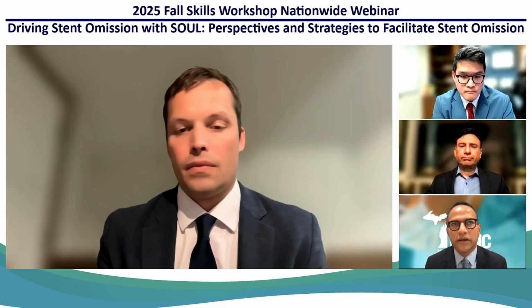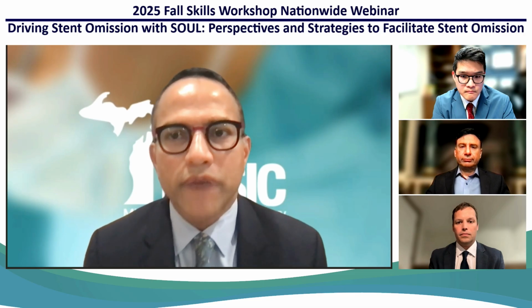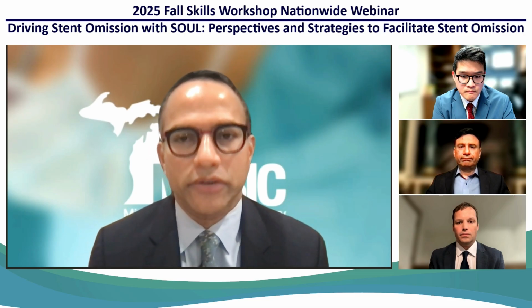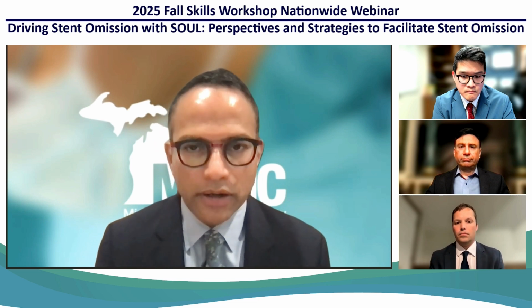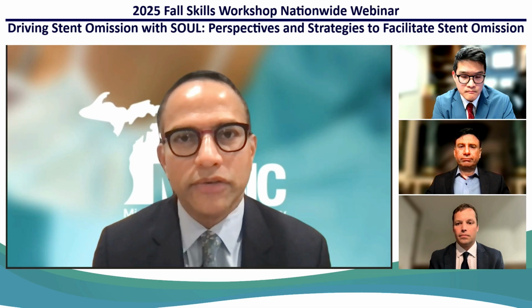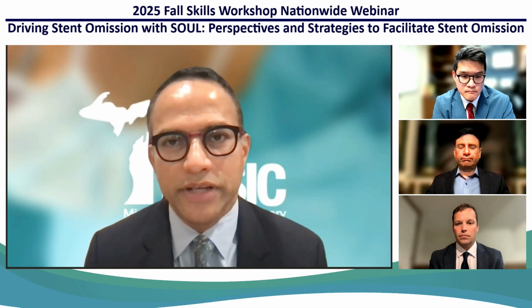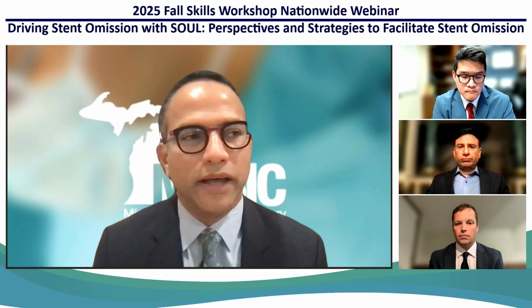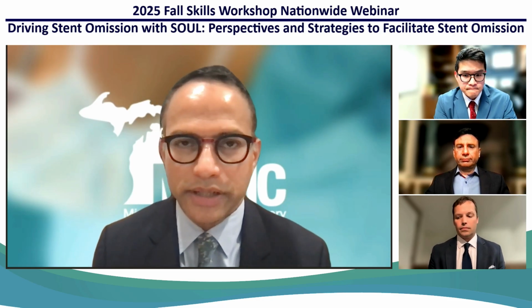Yeah, I'll start here. I have to say, it's really rare for me to even dilate the ureter, and I have an 8-10 dilator. It's rare. And I am absolutely convinced, and I credit Dr. Clayman from UC Irvine for this, he's saying that he puts patients on an alpha blocker and he can get access sheaths up easily.